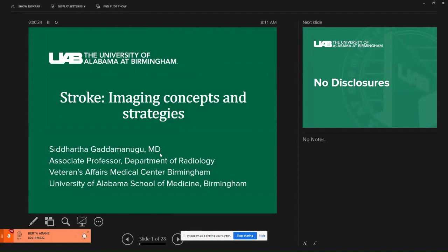So I'm going to talk today on stroke imaging concepts and strategies. It's a fairly common topic, as Ishwar mentioned, and a lot of change has evolved over the past few years, and there are also a lot of subtle variations in how we manage stroke and what the imaging protocol is.